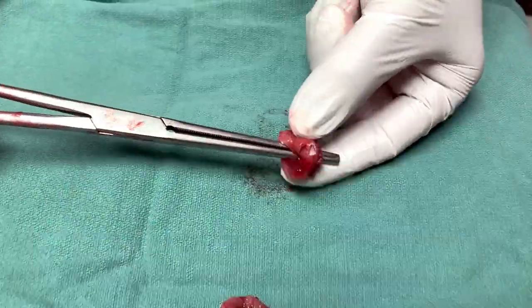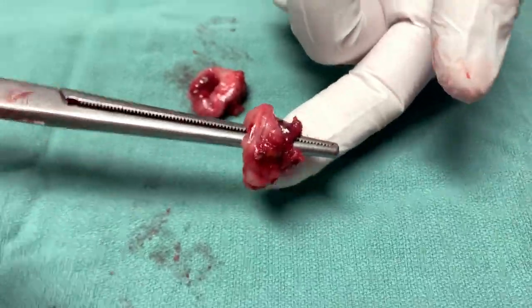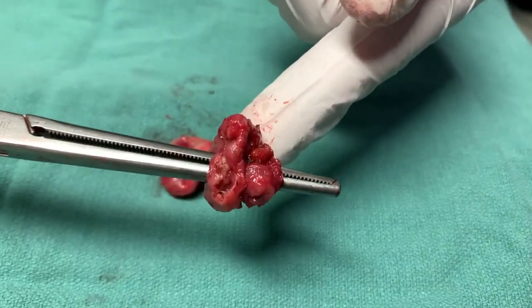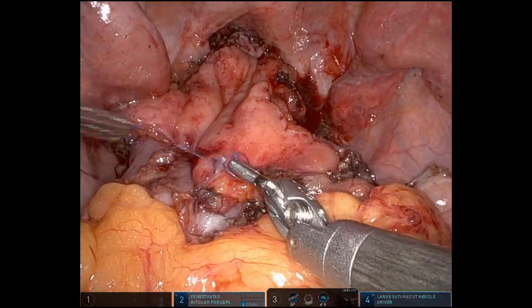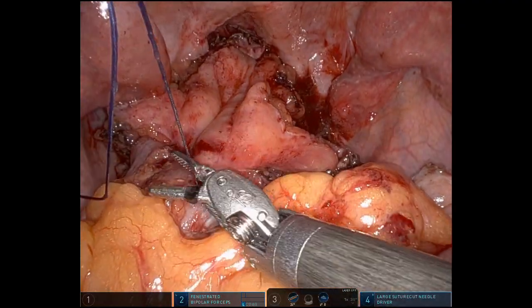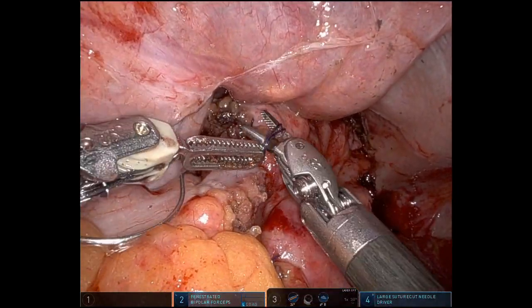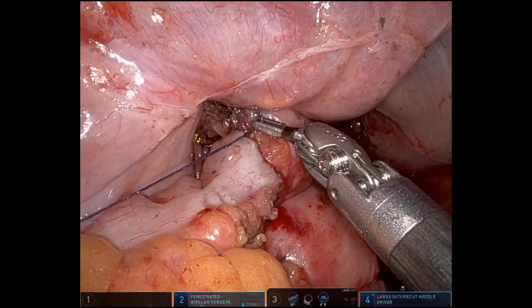At this point everything was looking good. We're checking the donuts. In addition to direct visualization, checking the donuts is so important because you can see here — this is the rectal part of the donut — where there's just a lot of thick tissue. Now when there's a lot of thick tissue in the donuts, whether it be the rectum or the proximal colon, I like to oversew pretty routinely about one to two centimeters apart, because I just want to engage that thick tissue in case it was too thick for the little staples.